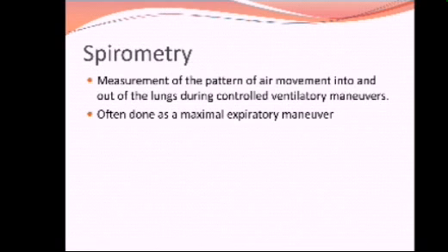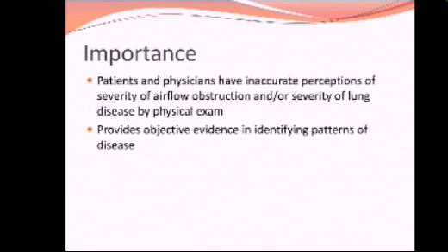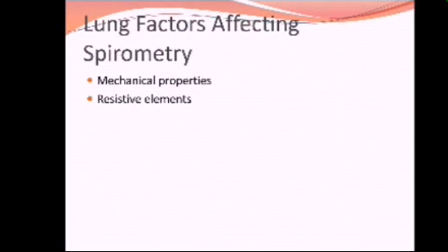Spirometry is the basic test which we do to measure the pattern of air movement into and out of the lungs during controlled ventilation maneuvers. The importance is very great because it is objective evidence in identifying patterns of diseases of pulmonary function.